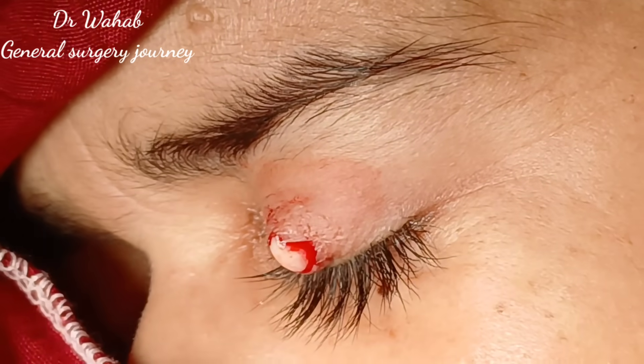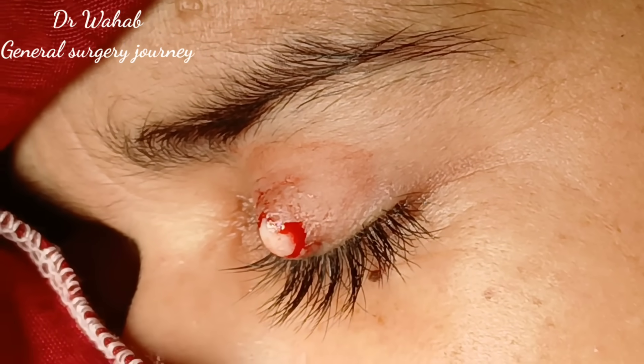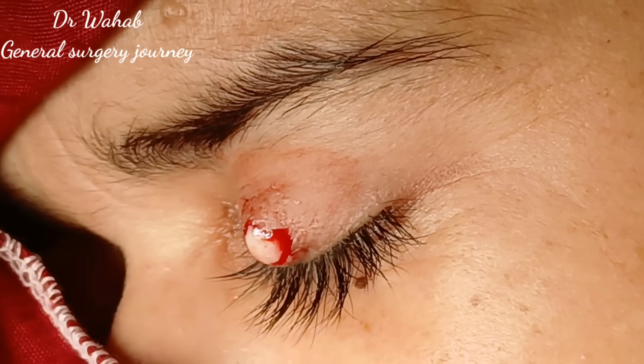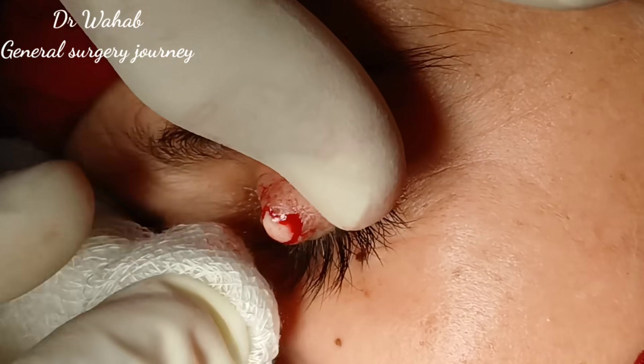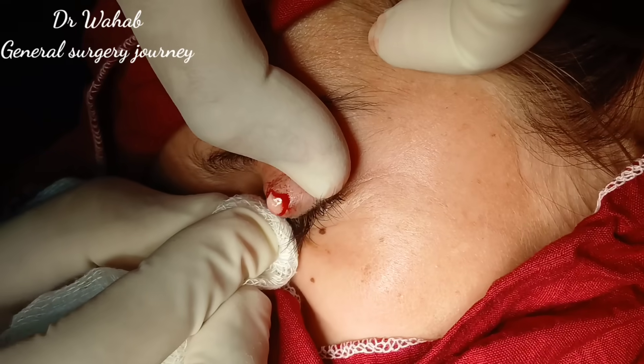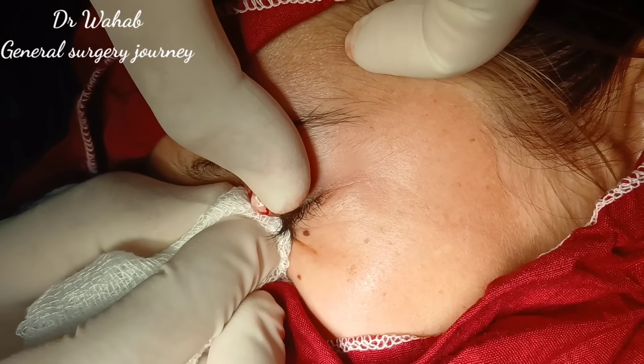During the expression, the cyst unfortunately ruptured, releasing its contents. This is a known intraoperative possibility, especially with long-standing lesions.